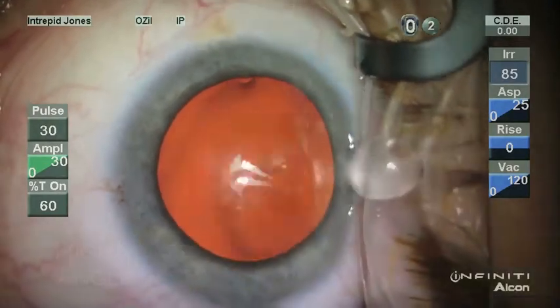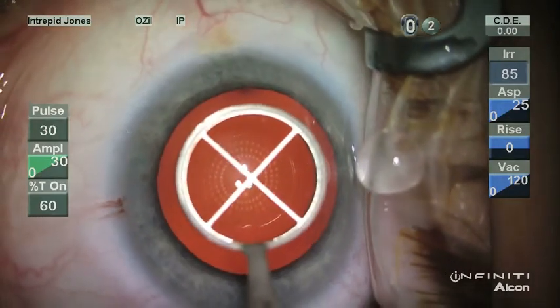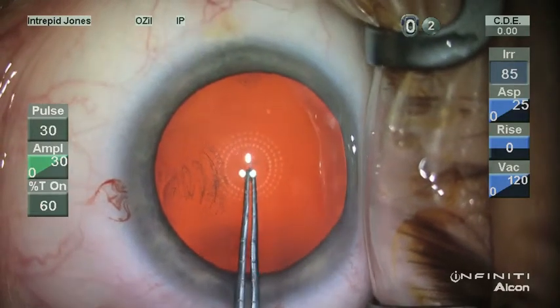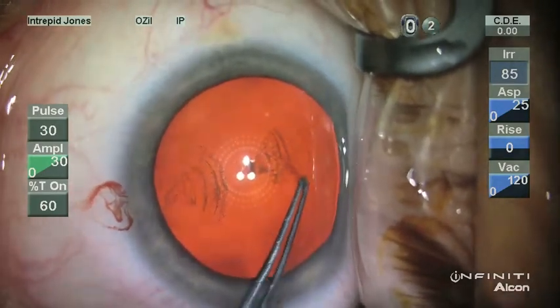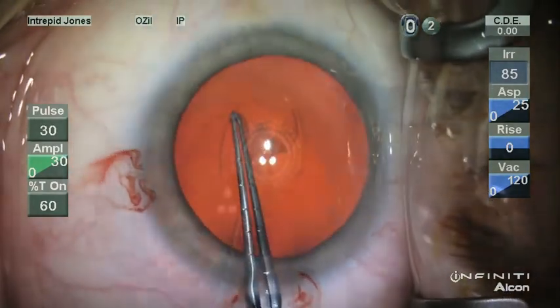Here in this highly myopic patient, we once again apply our corneal marker while the patient is fixating, judge the size of our capsulotomy, and create our capsular opening following the diagram of the corneal marker.